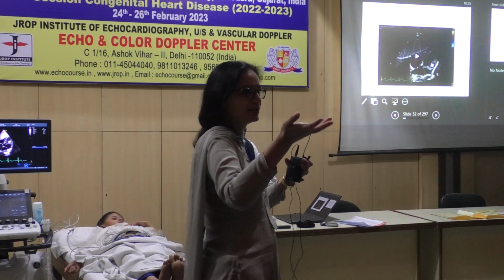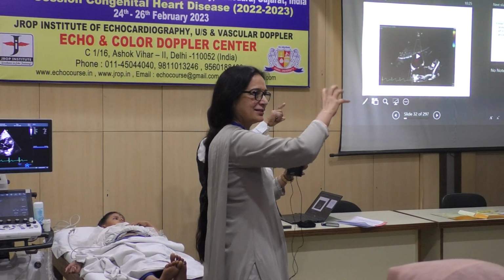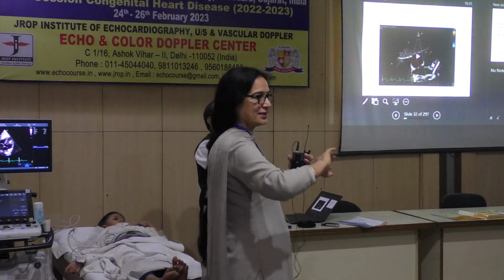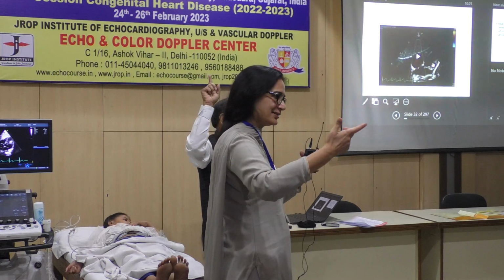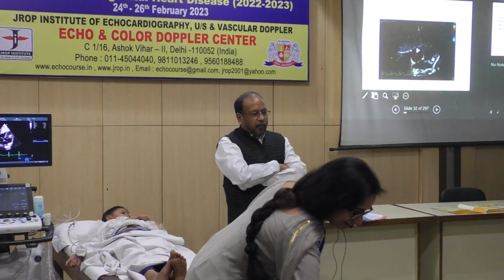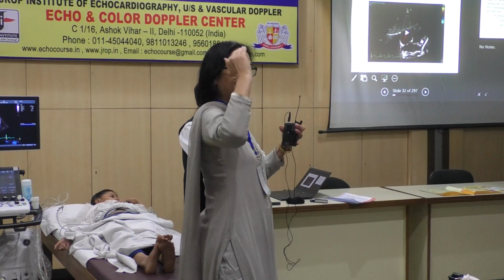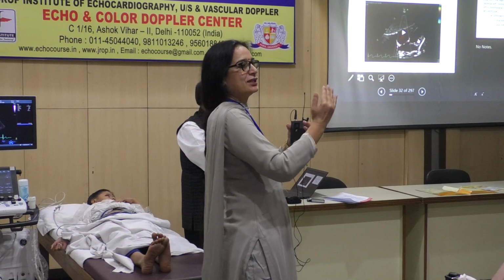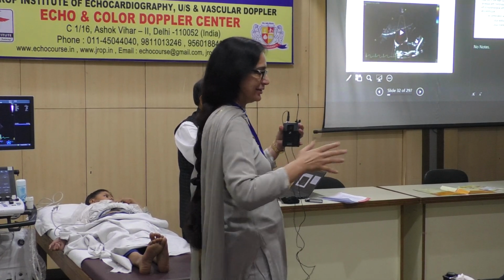Sometimes it is difficult, especially in grown-ups. In pediatrics, we can very comfortably define this as the right atrium, with a broad-based, prominent pectinate muscle, while the left side has the typical structure. For pediatrics we are very clear, but in adults there is an image issue. The Eustachian valve flap and suprahepatic IVC define our left and right atria.